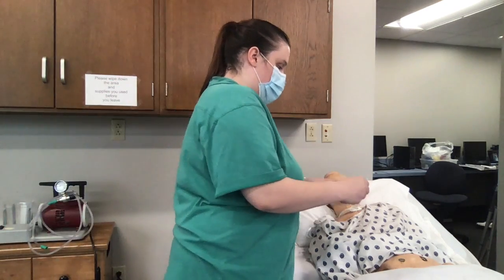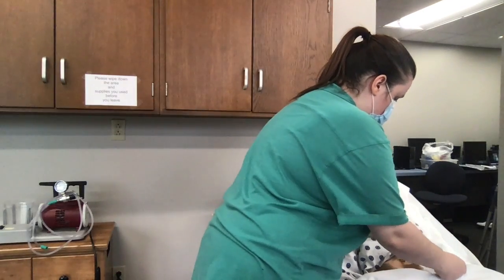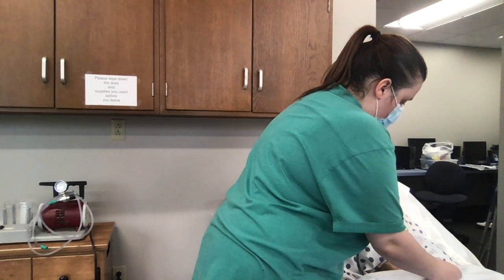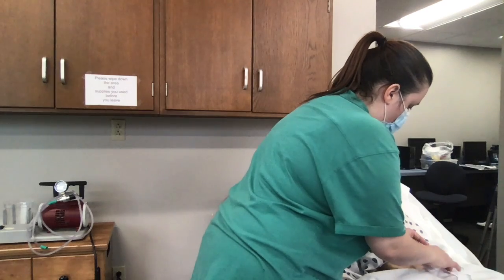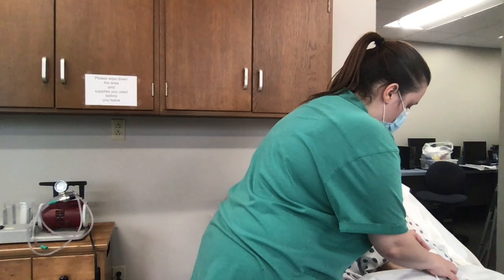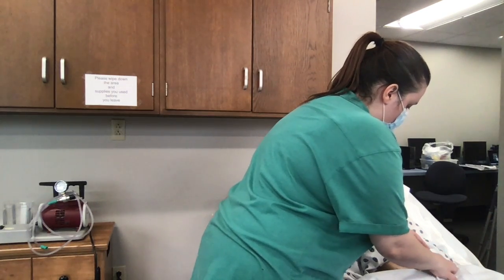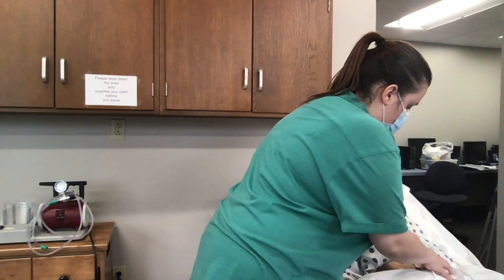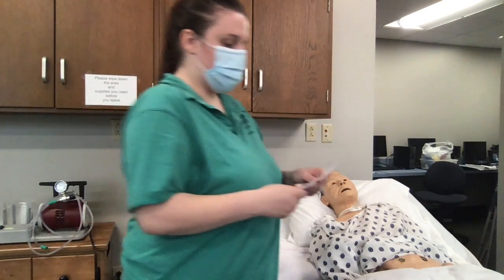So when measuring it, I don't want to touch the patient with it. So I'm going to look. I don't want it to be too big. I want there to be some space around the stoma, but I don't want it to be too tight around it, and I don't want it to be too big. So this one looks like about 32 millimeters or 1¼ inches.